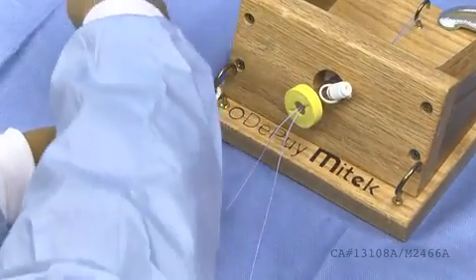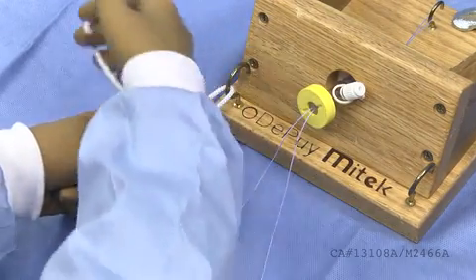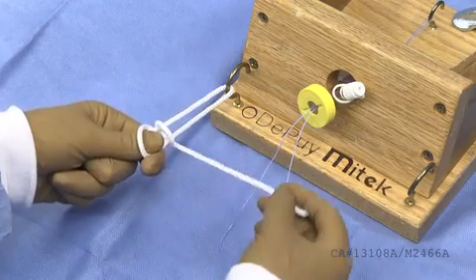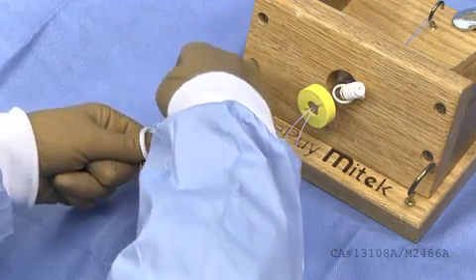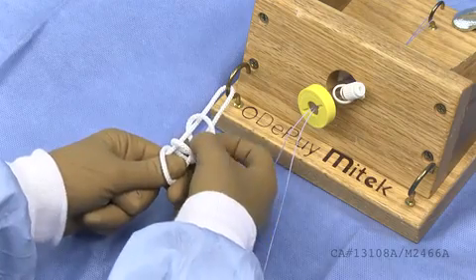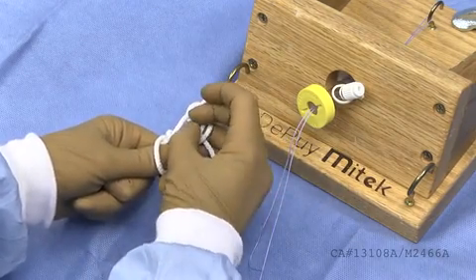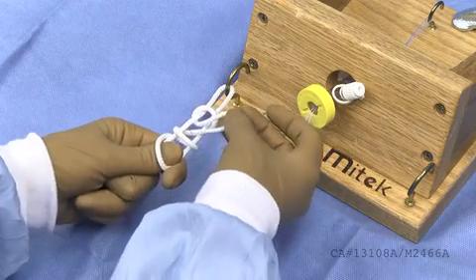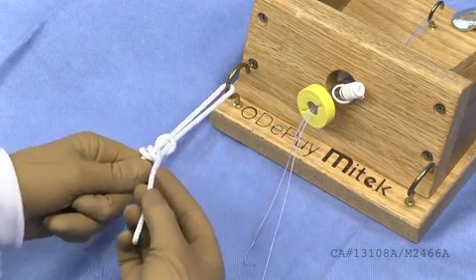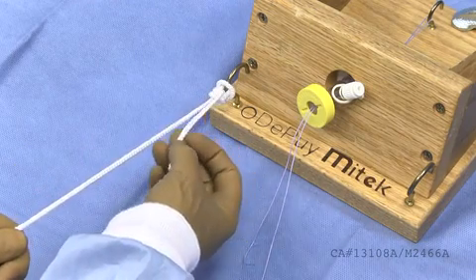After shortening your post strand, throw three overhand loops. Bring the suture up through the middle, proximal to the third loop. Slowly dress the knot and pull on the post strand of the suture to slide the suture to the desired location.